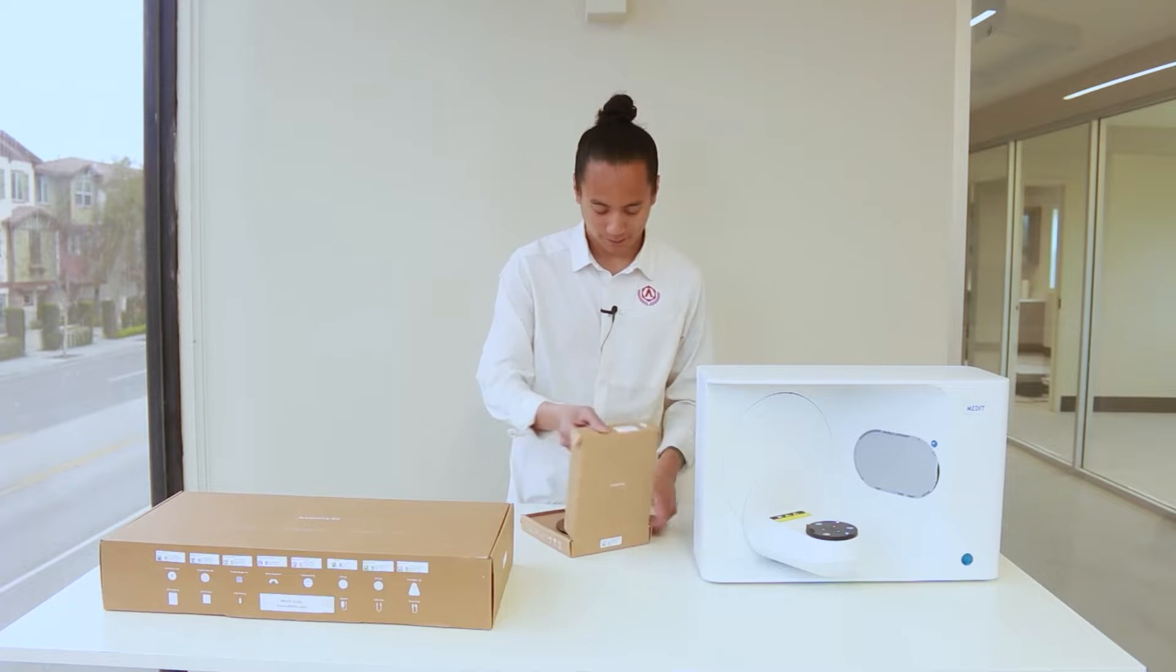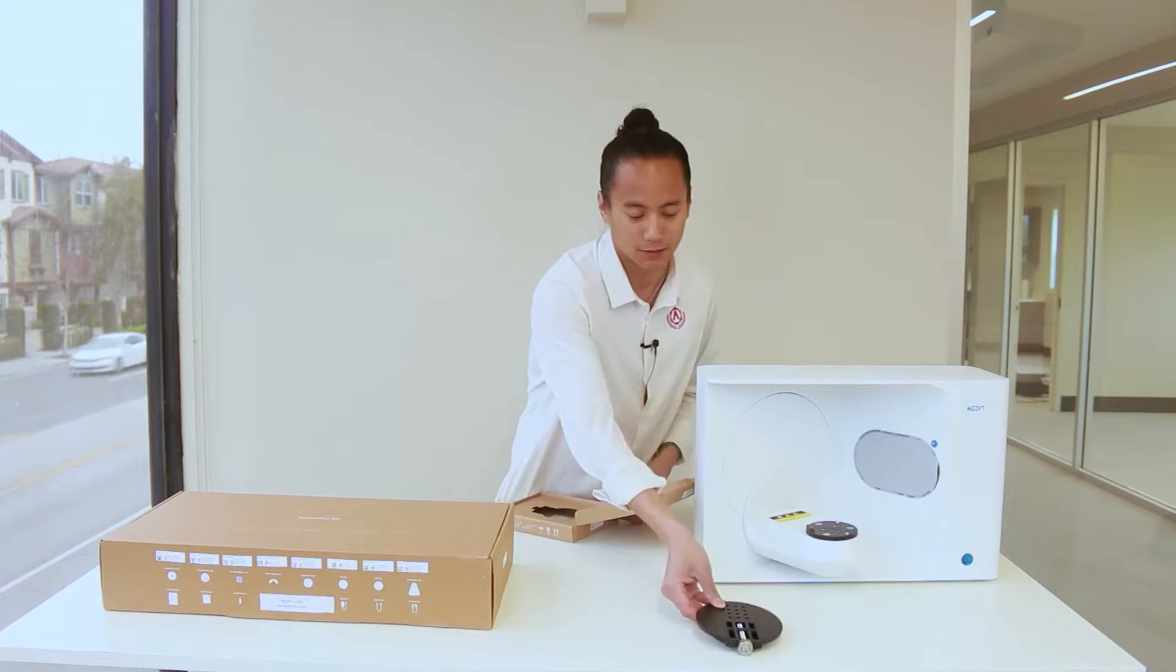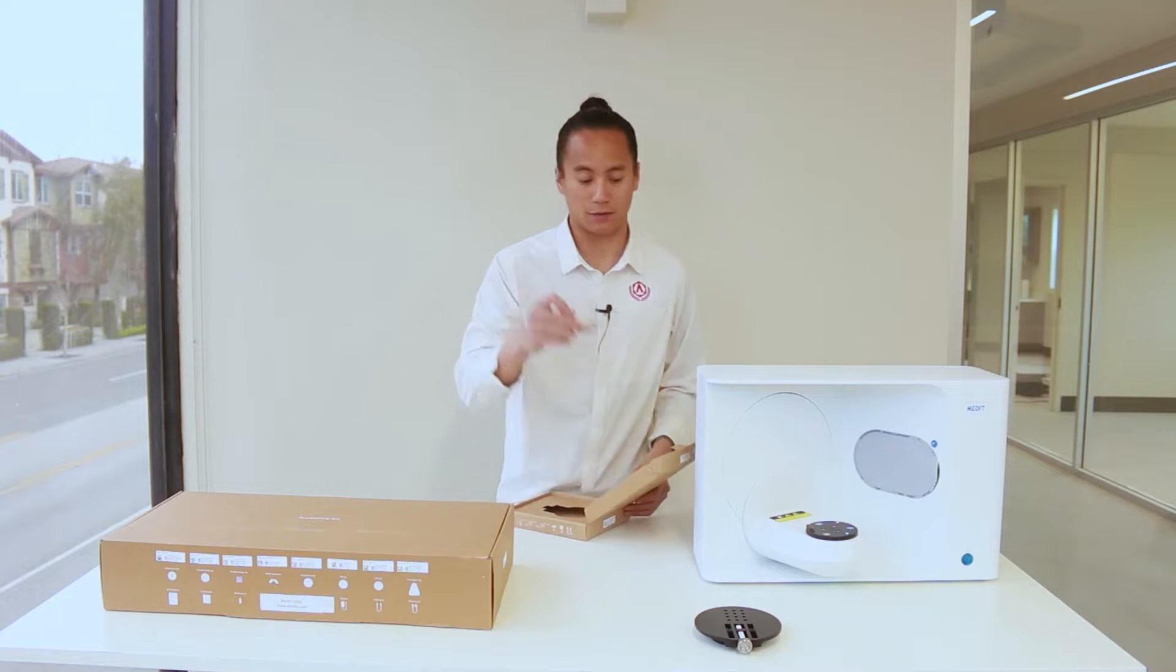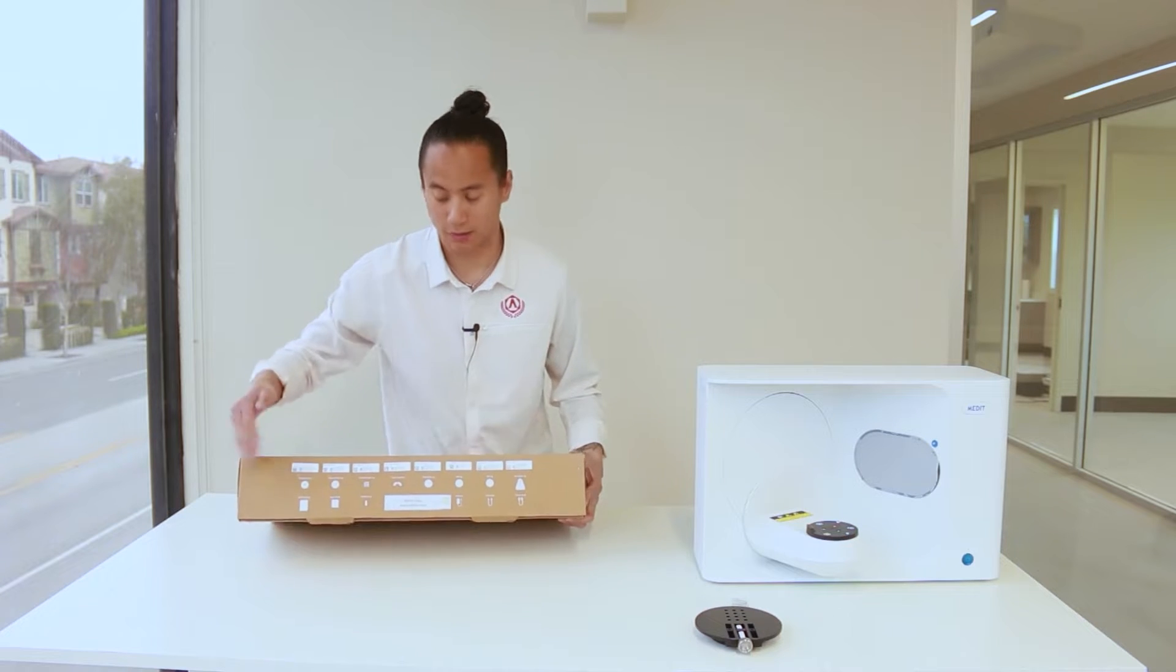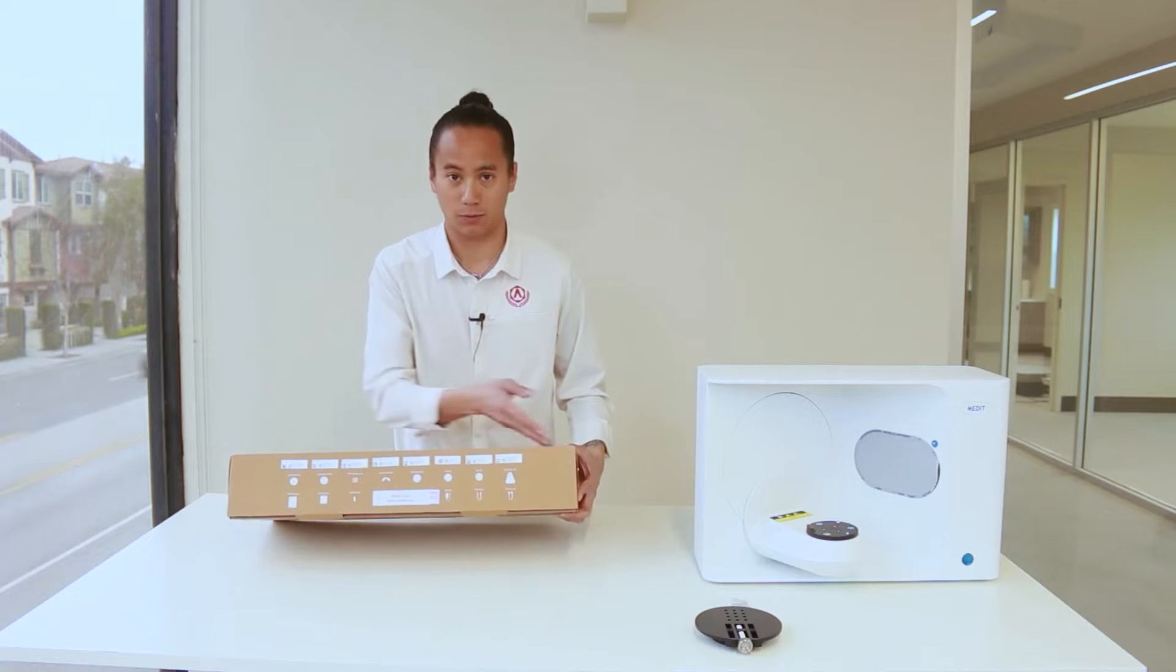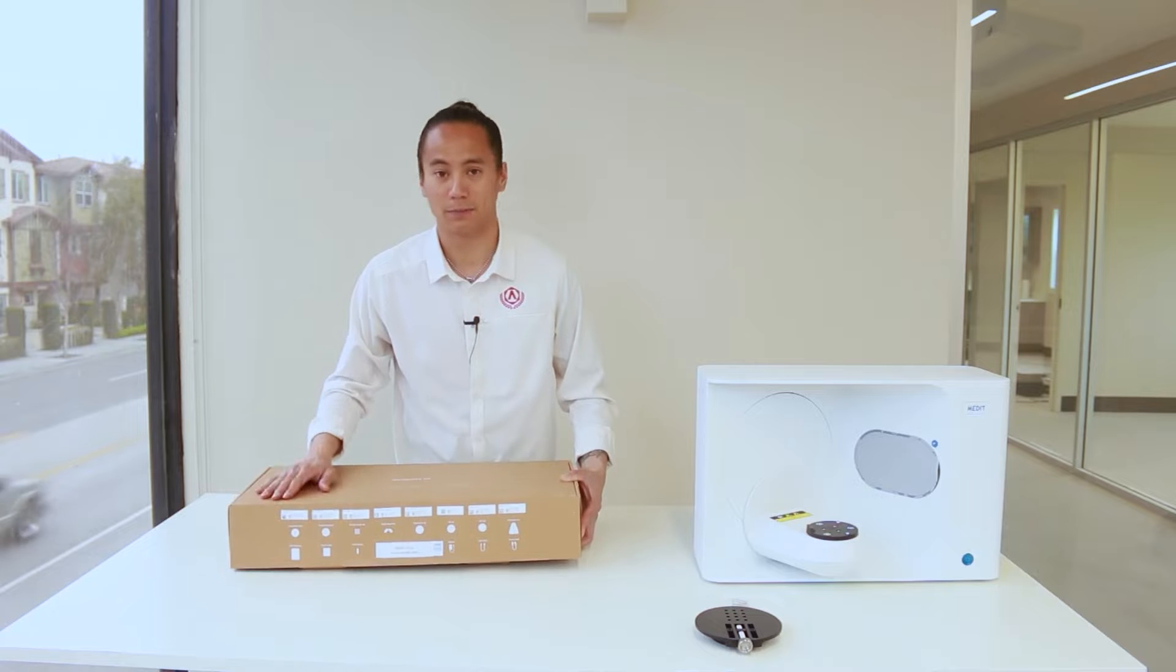The first accessory we're going to go through is the screw jig. Take this, place it up here. These are the packet of screws for the jig. Now, if we ever forget what each accessory is, the accessories box has a label for each individual item that's in the kit.